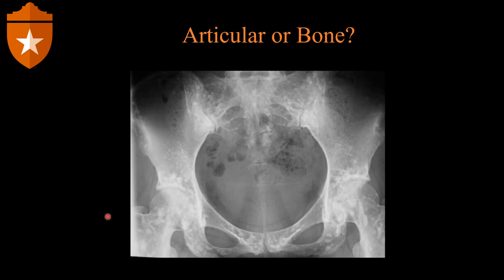Let's look at some examples. We have a pelvis AP view with multiple round sclerotic lesions throughout the pelvic bones, centered around the articulation. These lesions appear to be on both sides of the articulation; however, the articulation appears normal — there is no joint collapse, bone destruction around the articulation, or evidence of radiographic effusion. These are multiple bone islands, also known as osteopoikilosis. Although the multiple lesions are on both sides of the articulation, the articulation is normal, so this is a bone process.